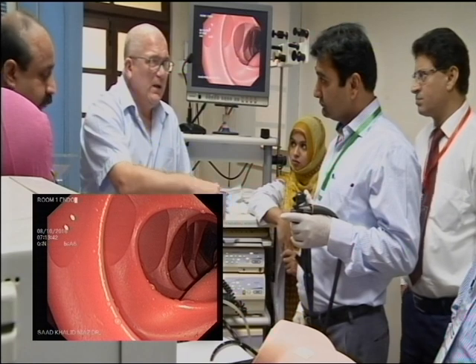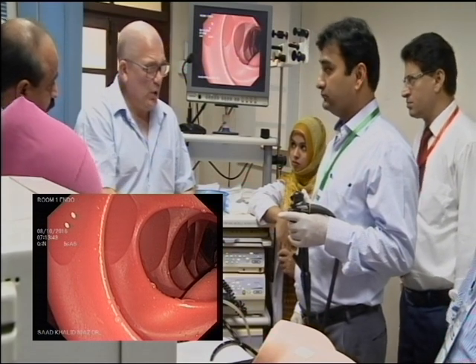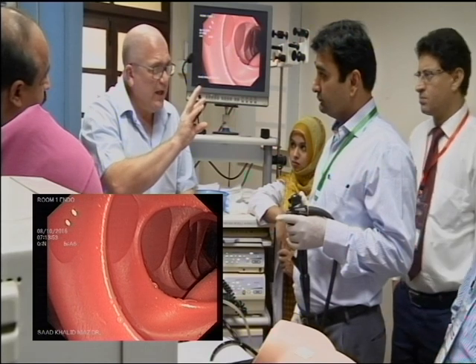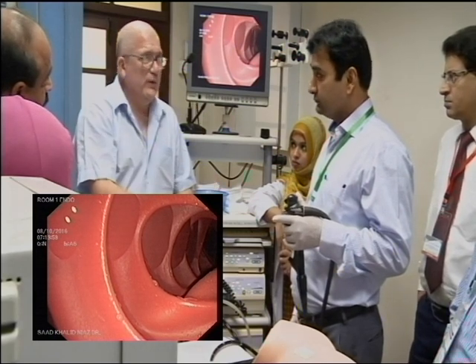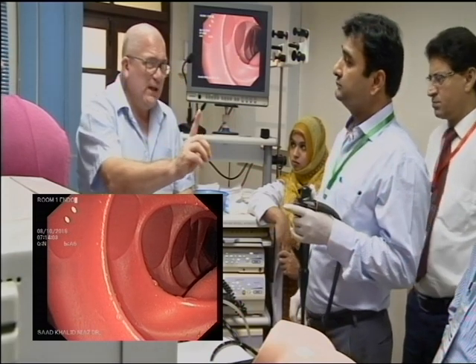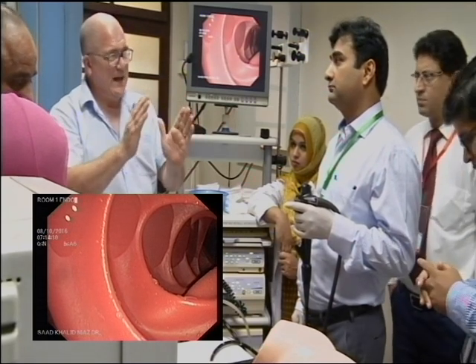And the final most important thing you did, we got you to do one thing at a time, but the things that you did were the right things to do in the right order and did them slowly. And therefore, when things started to change, you stopped doing that and then you were able to apply the next movement to actually maintain the view. So going slowly enables you to see what options to make the view stay stable.